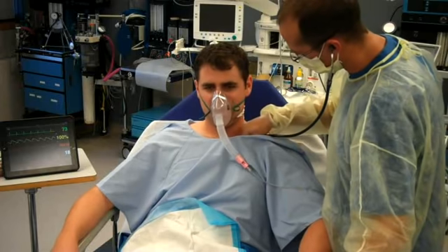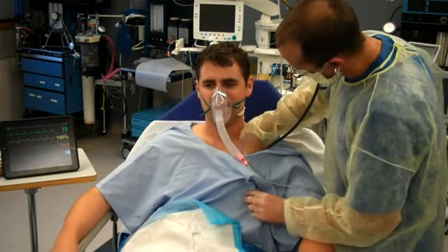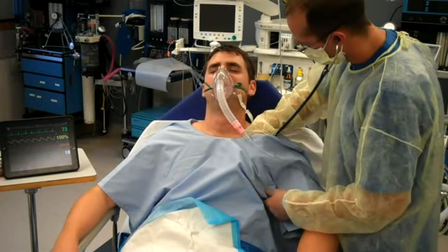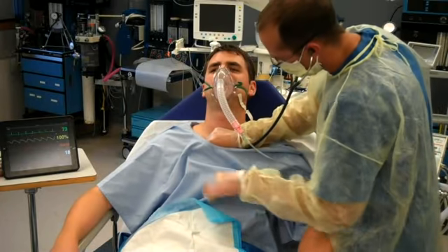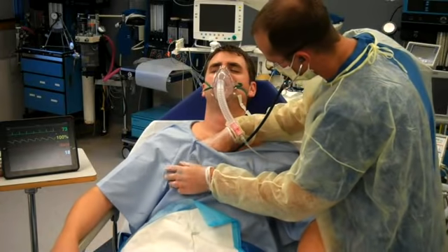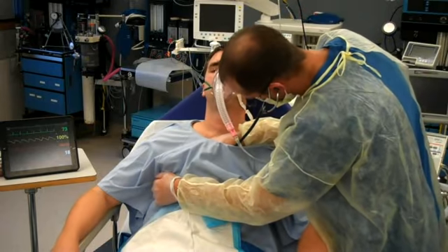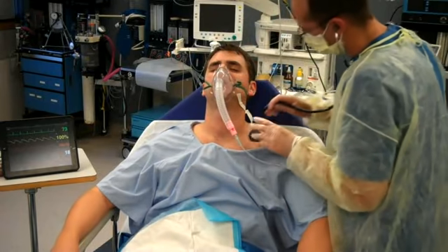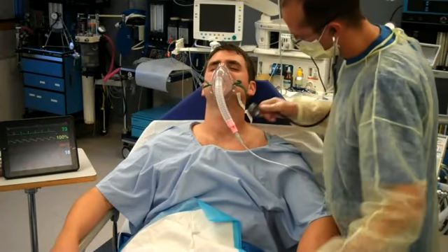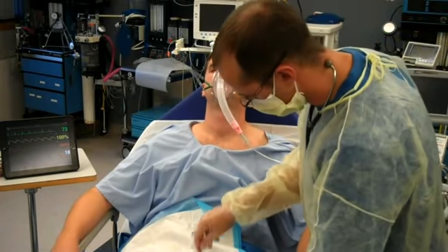Get some nice big breaths in there for me. Good. Okay, you still have some tape on your neck — I'm just going to see if I can take that off. Just clean up all the stuff here.